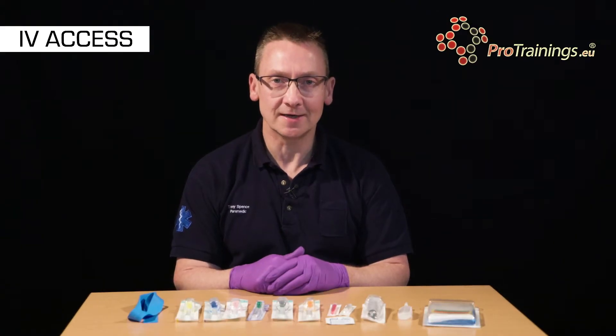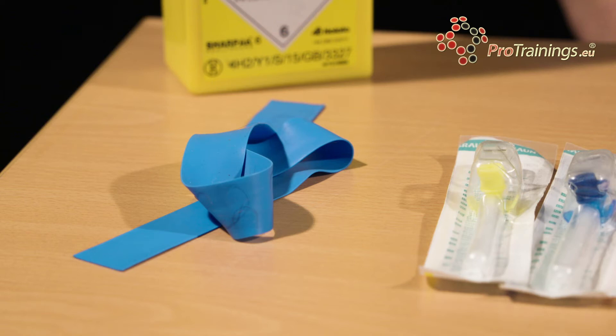In this video we're going to look at gaining intravenous access in a patient. We'll be looking at the equipment that we need to carry out that procedure and we'll go on then to insert a cannula into a vein in a patient's hand.